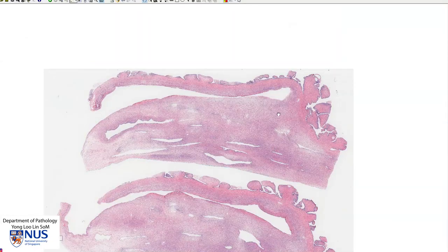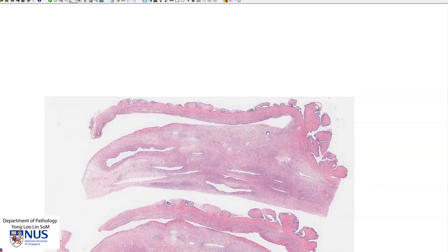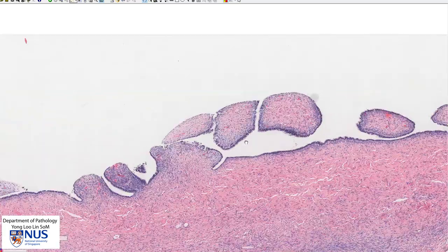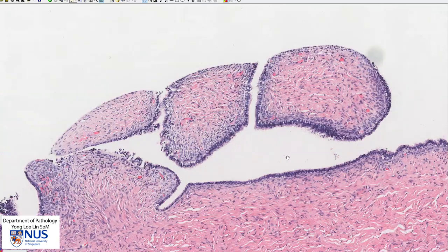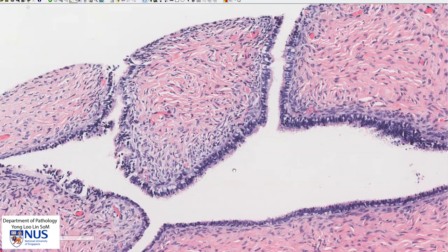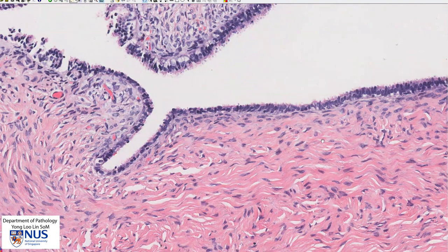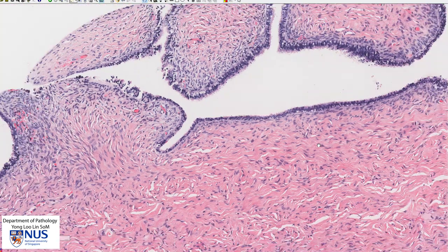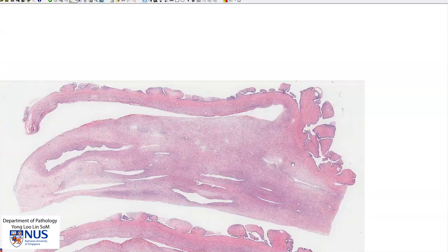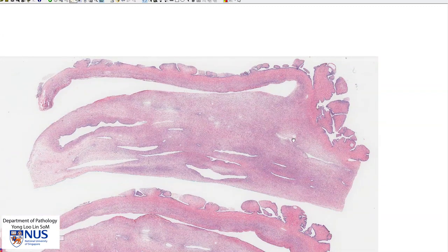In summary, this is a serous cyst adenoma of the ovary where we can see cyst locules that are lined by a single layer of ciliated columnar cells which resemble tubal epithelium, and underlying the epithelium we can see dense collagenous stroma. This tumor can also sometimes have more proliferative or atypical features, in which case it is called a serous borderline tumor. There can also be a malignant counterpart which is serous carcinoma or serous cyst adenocarcinoma. There will be a separate video showing the microscopic features of serous carcinoma of the ovary.